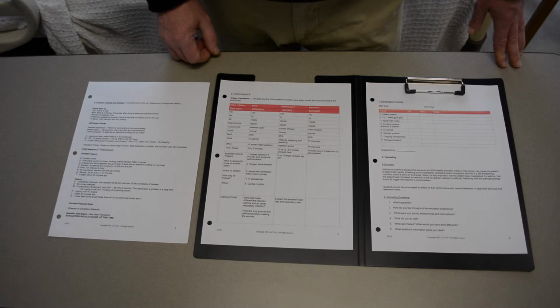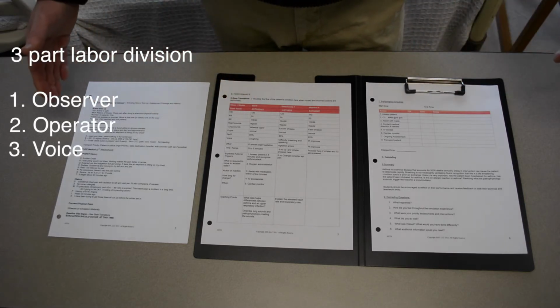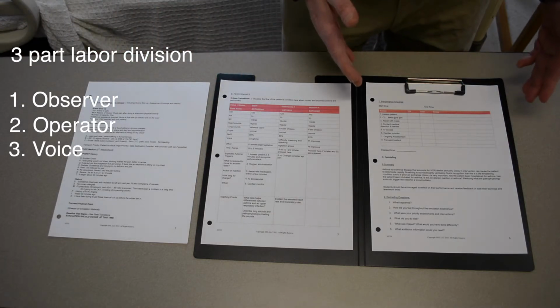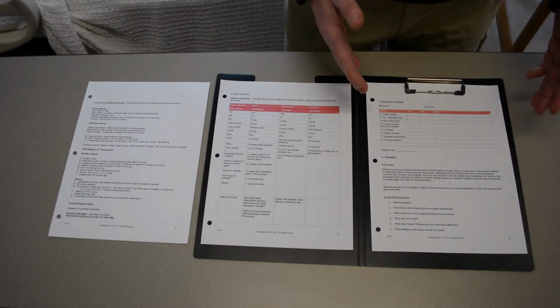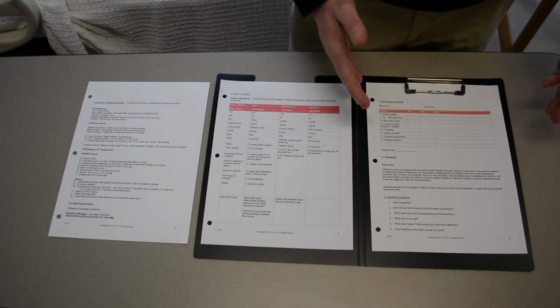Breaking the scenarios into pre-performance, performance, and debriefing is a logical organization, but when taken separately, the 3 pages of each scenario reflect the division of labor that is needed to operate the mannequin. We have, most importantly, pre-written checklists for the observer to record actions versus expected actions and comment on performance.